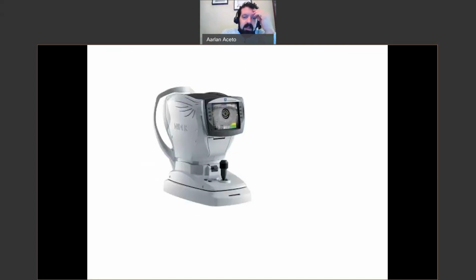Now again, these were the limitations. So this is what's called an autorefractor autokeratometer. If you look at anybody who's ever had an eye exam, one of the first things they do when you sit at the table in the doctor's office is have you look into a little machine and you see either a hot air balloon or a farmhouse at the end of a road. What that's doing is giving you a fixation target. And this machine helps us determine the approximate refractive error of a patient before they ever tell the doctor which is clearer, 1 or 2, to refine the prescription. That's called an objective autorefractor.